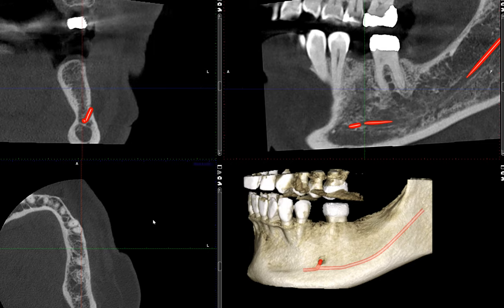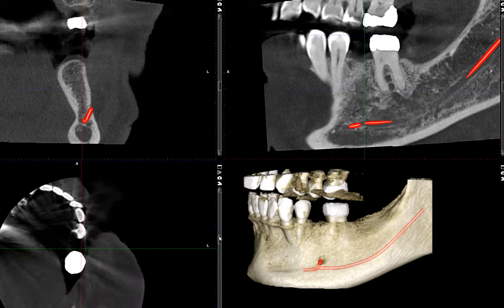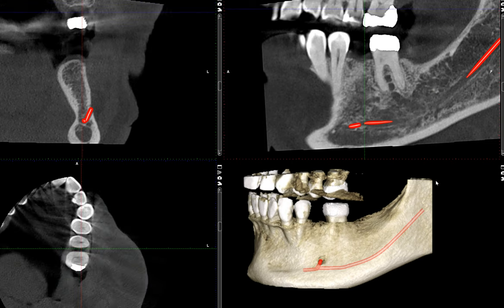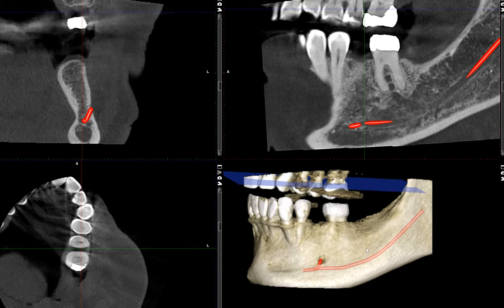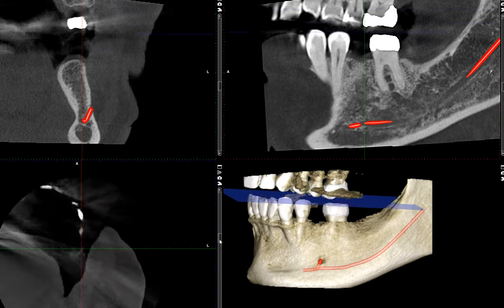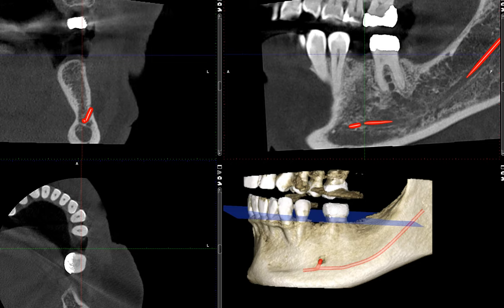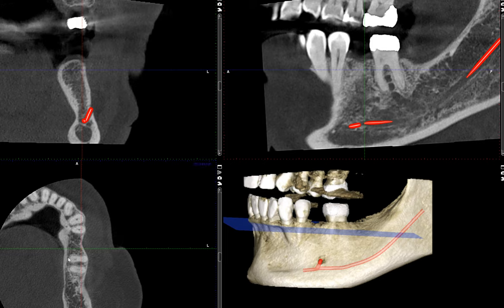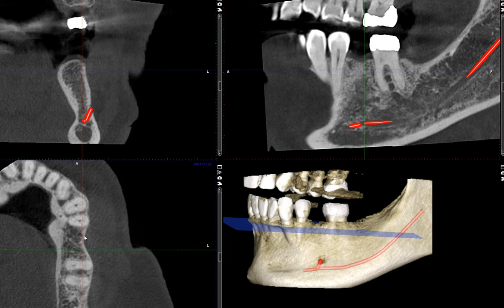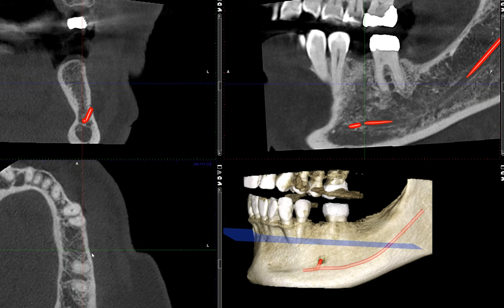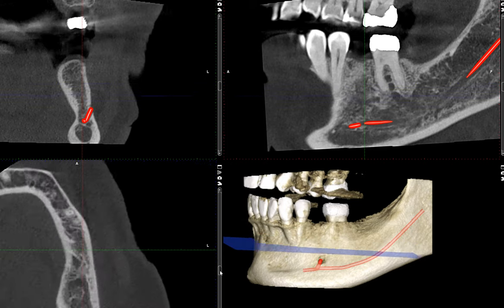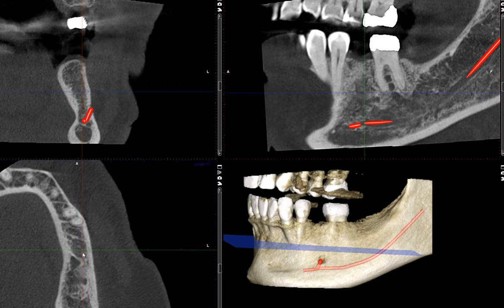Let's go ahead and start with the axial view like I always do. I'm going to turn on my axial plane just so that you guys know which plane I'm looking at. Scrolling down, here we're seeing the crowns of the mandibular teeth. Moving inferiorly, we're seeing the ridge — this is the area of interest. There appears to be a slight loss of the width of the ridge, a depression. The buccal cortex is intact, as is the lingual cortical plate, with underlying bone that appears relatively normal. You can still see the outline of the lamina dura.